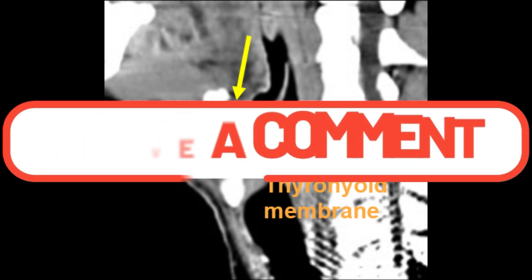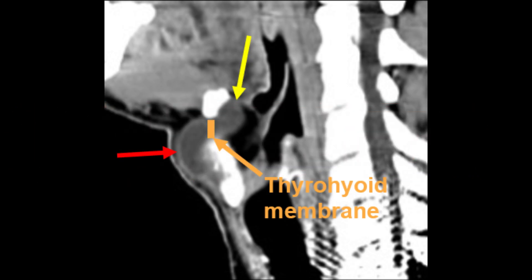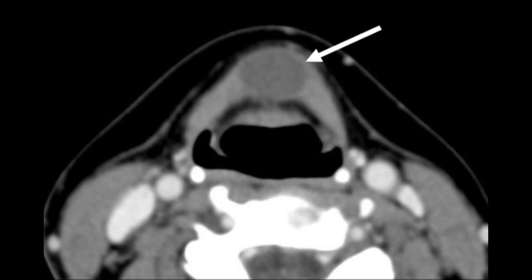The diagnosis in this case is a thyroglossal duct cyst with extension into the preepiglottic space. Let's review some key facts about thyroglossal duct cysts. These are embryological remnants of the thyroglossal tract and are the most common congenital midline neck masses. On imaging, they typically appear as well-defined cystic lesions along the midline.